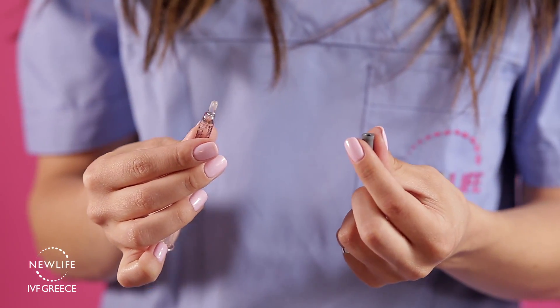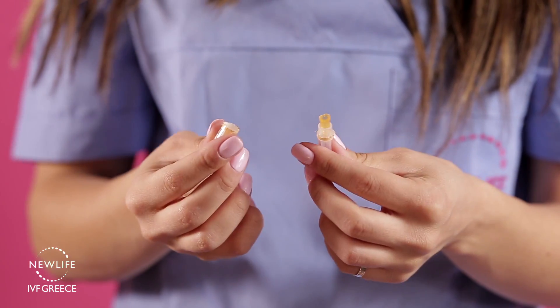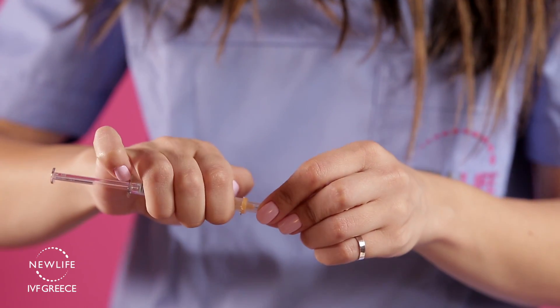Take the first pre-filled syringe, remove the grey rubber cap, take the small needle, attach it to the syringe, and carefully remove the protective cap.